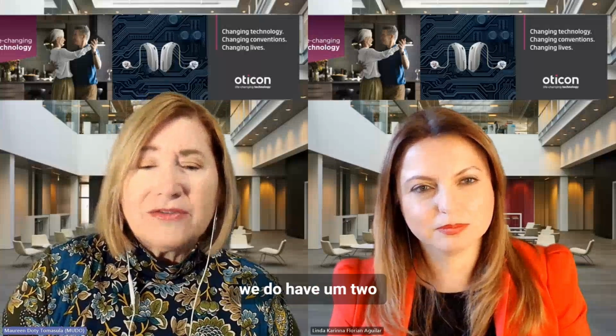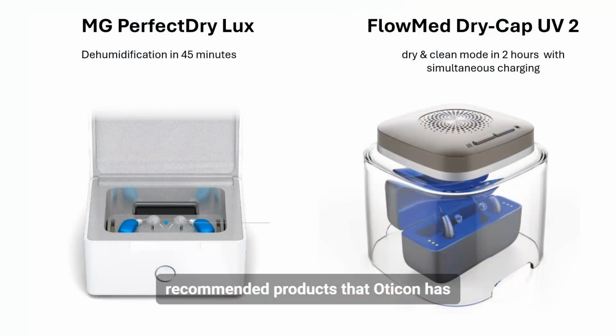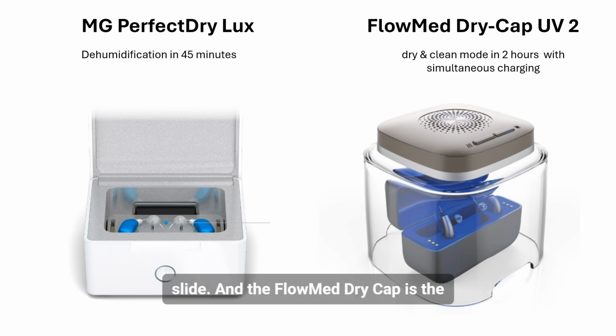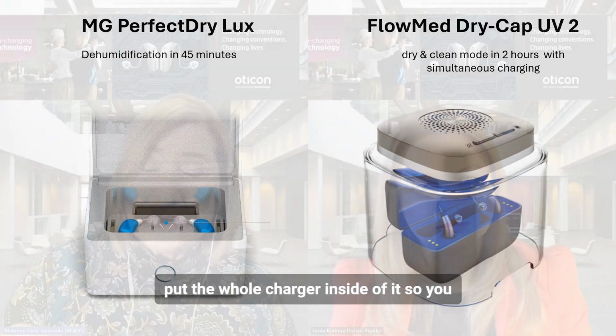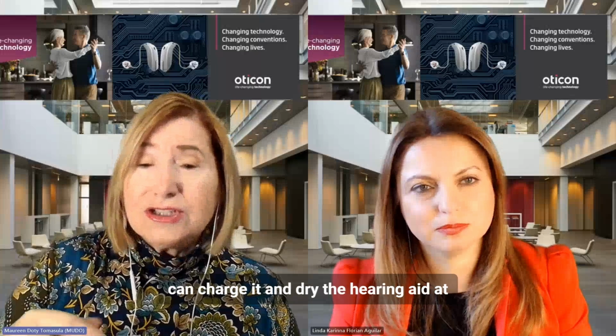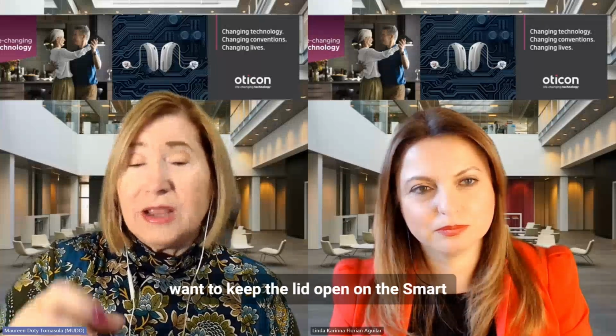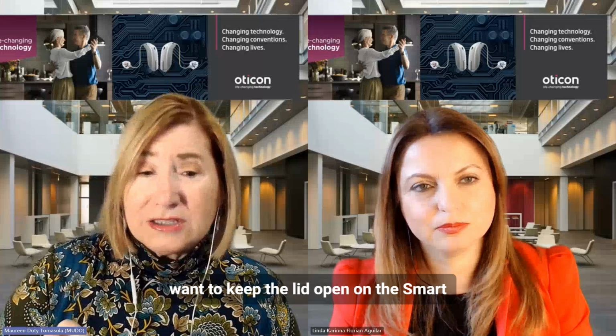So we do have 2 recommended products that Oticon has tested, the Perfect Dry Lux and the FlowMed Dry Cap. I get them confused, but their pictures are shown here on the slide. And the FlowMed Dry Cap is the larger one. It's the one you can actually put the whole charger inside of, so you can charge it and dry the hearing aid at the same time. Of course, then you would want to keep the lid open on the smart charger.